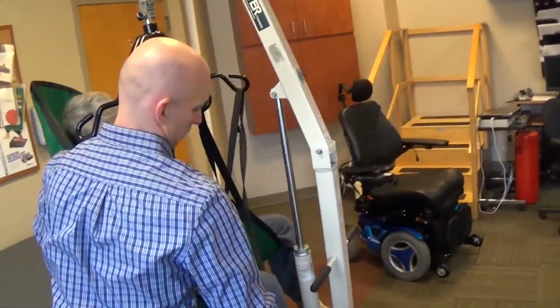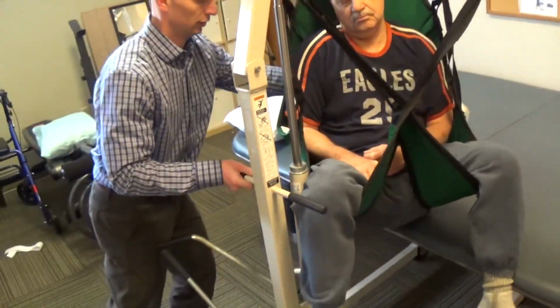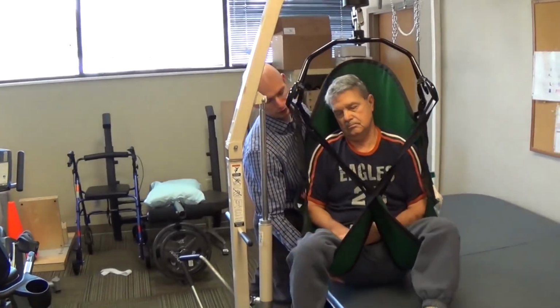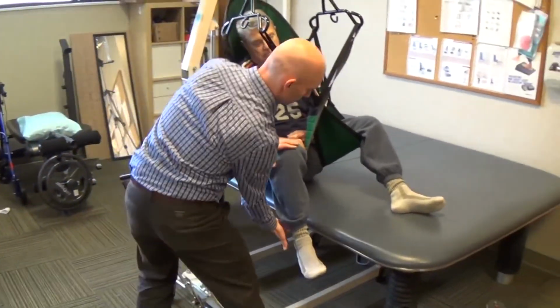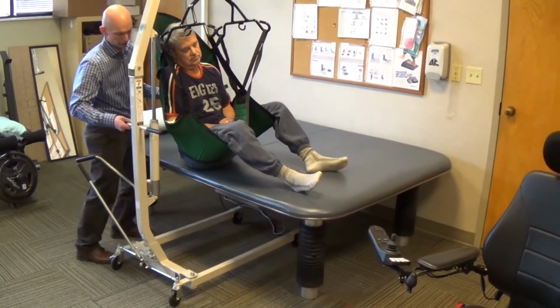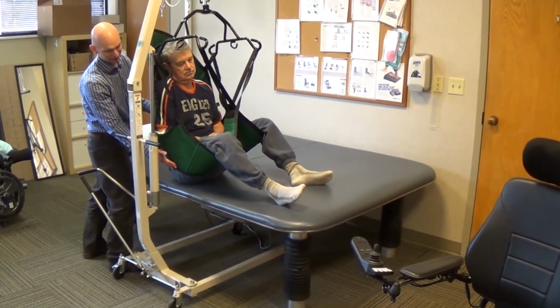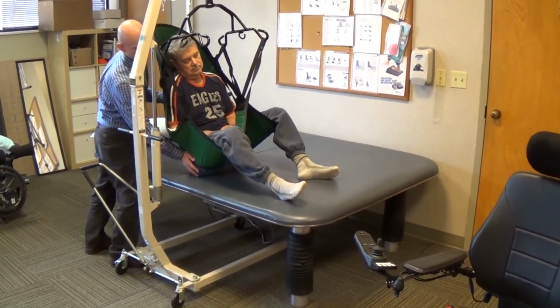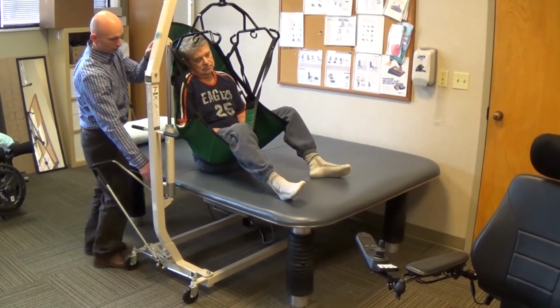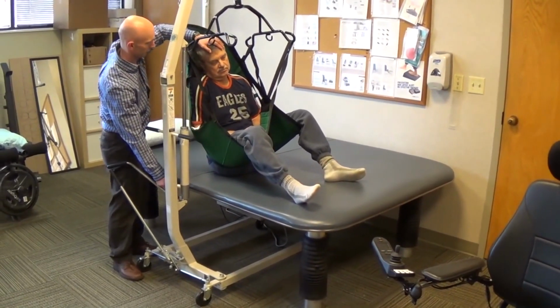I'm going to use the handle. I'm going to move the leg around. And then I'm going to push in. Depending on the heights of some beds, you still might be required to do a little bit of lifting. Pushing the lift all the way in, and then it's easier to move the person when their weight is supported by the lift, and moving them towards the middle of the bed where they will be laying. Next, locking the brakes again, and then slowly lowering the lift back down.